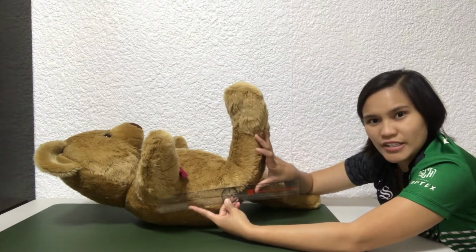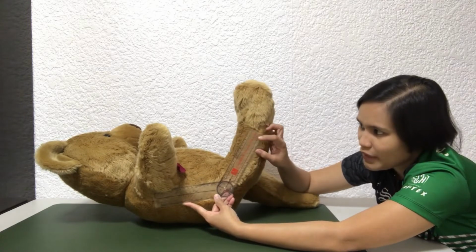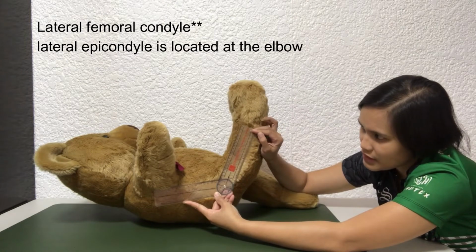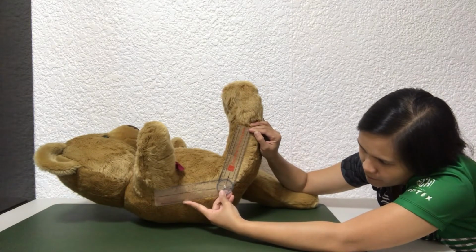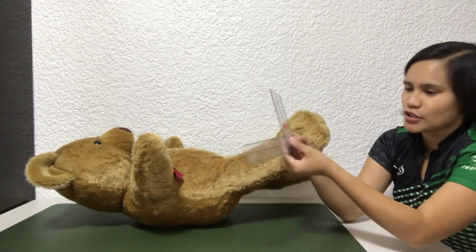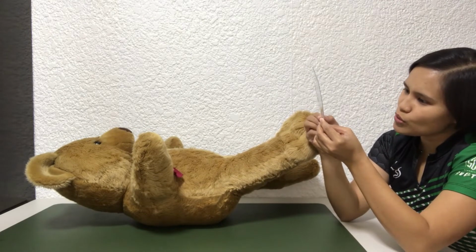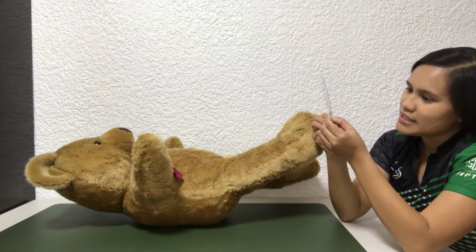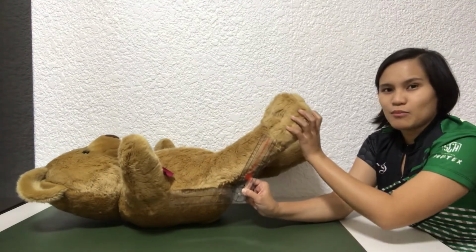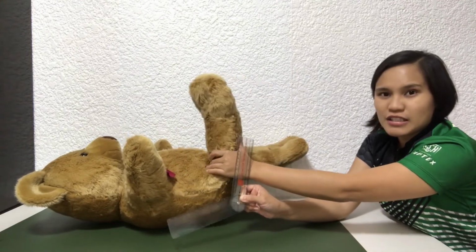The stationary arm would stay on this side, but the moving arm would follow the movement and still align on the lateral epicondyle. So, for example, it is still here. Alright. Now, as you can see, this is the angle that we got for Mr. Teddy. We can read it as 0 to, not 75, 65 degrees. So, meaning, the hip flexion of Mr. Teddy is from 0 to 65 degrees.